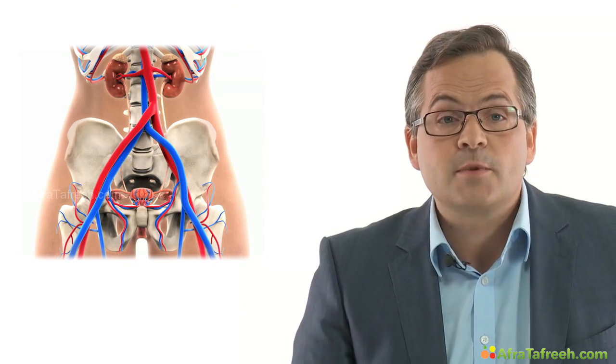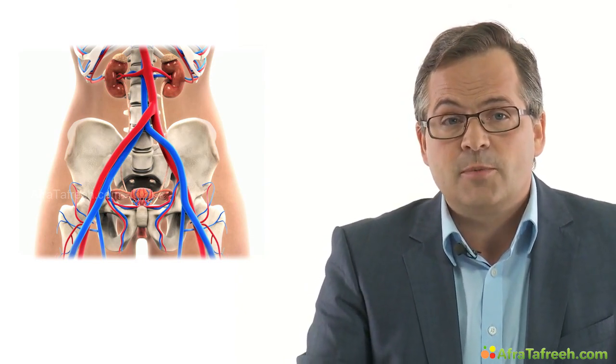The female lower abdomen. First, we take a few moments to repeat the anatomy of uterus, ovary, and fallopian tube. Uterus, the gonads, and the fallopian tube are situated in the lower female abdomen and can be examined by vaginal sonography. The transabdominal sonography can be of great help, especially when the bladder is filled.